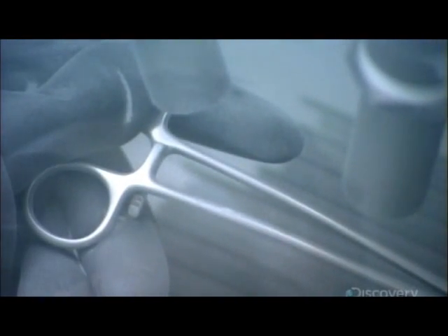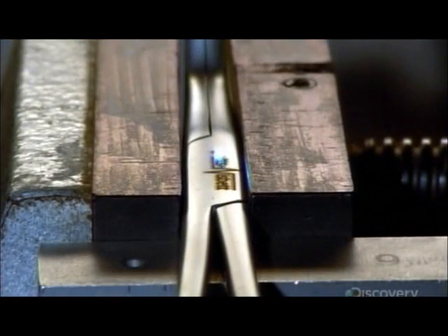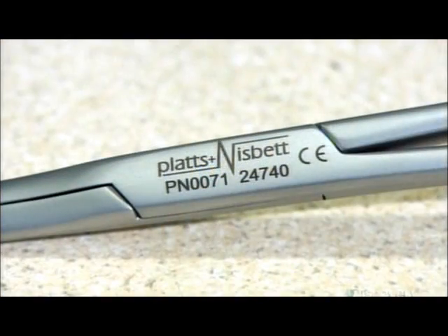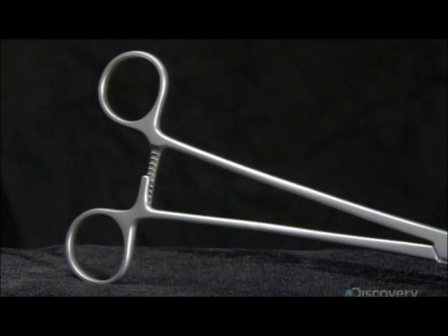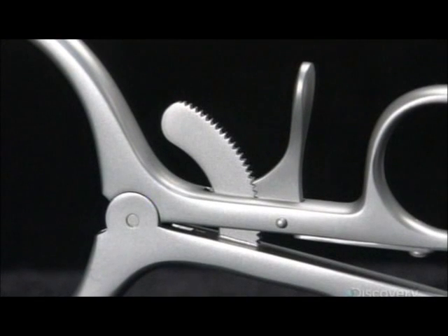After heat treatment to strengthen the metal, they blast it with fine glass particles to give it a satin finish. They laser etch the company name and identifying numbers onto the surgical clamp — the numbers will allow the tool to be traced back to a particular production run. And now it's ready to take its place on the front lines of healthcare.